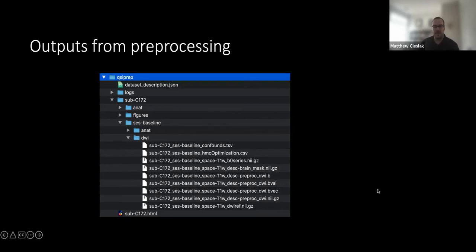One of the issues is that the orientation used internally inside of QSIPrep is LPS+, which is the same as the internal coordinate system of ANTs. And that makes the rotation of gradients and the transforms of images really easy to keep track of. The b-val and b-vec format only works if the images and the b-vecs are in the same orientation. And since FSL is expecting a different orientation, it doesn't work. So MRtrix interprets these incorrectly. If you use the .b file, it will work perfectly with MRtrix.